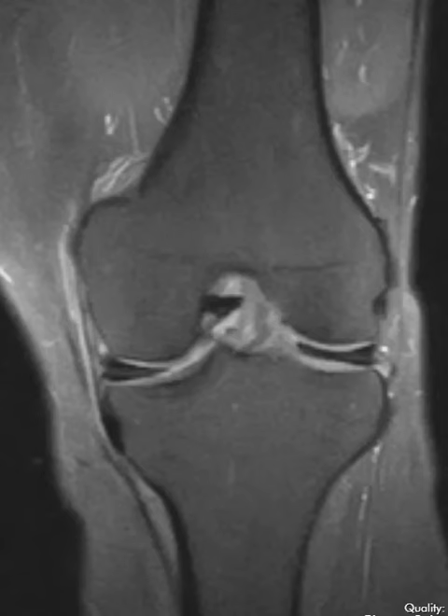Hello, this is Dr. Gay from FirstLake MRI and this is an example of a discoid lateral meniscus.